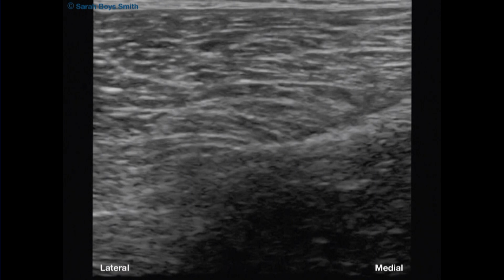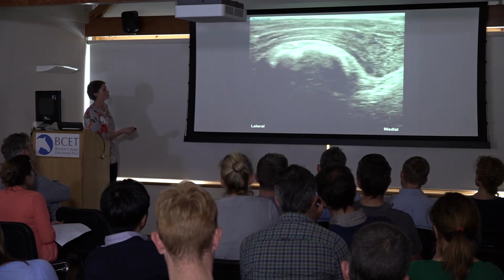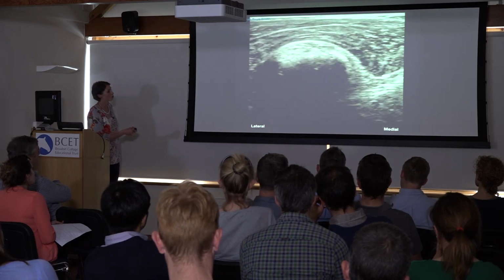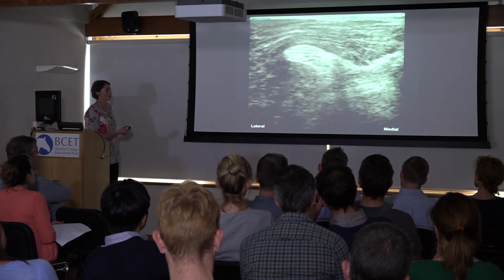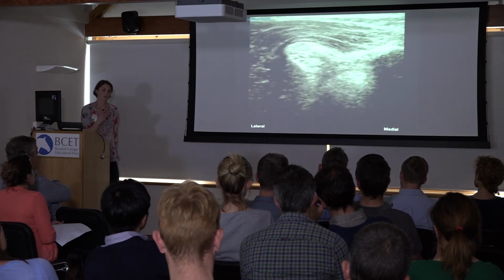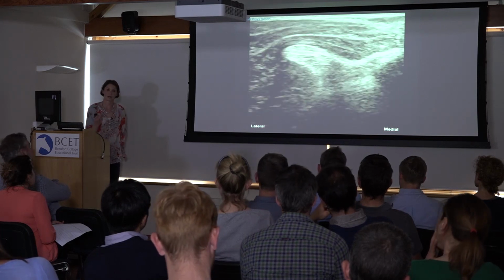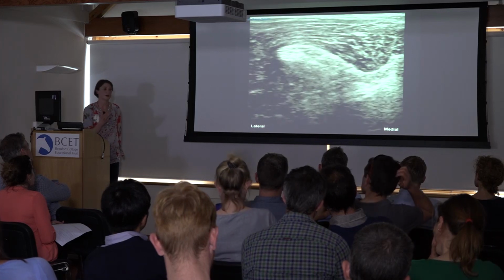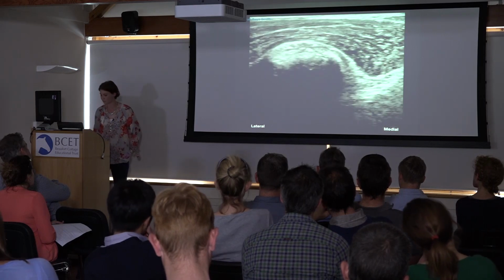So in transverse, this is our dorsal part of our dorsal sacroiliac ligament here. This is our tuber sacrale. This is the fusion of the thoracolumbar fascia coming from the medial aspect. The size and shape of that ligament changes quite vastly between individuals. In this individual, it's quite thin before becoming more comma-shaped and inserting onto the sacral spine, just coming into view here. In other horses, that ligament is much thicker. There's a huge range of variation between individuals, and it's therefore very important to scan left and right side in order to compare, to make sure that you don't overinterpret any abnormalities.